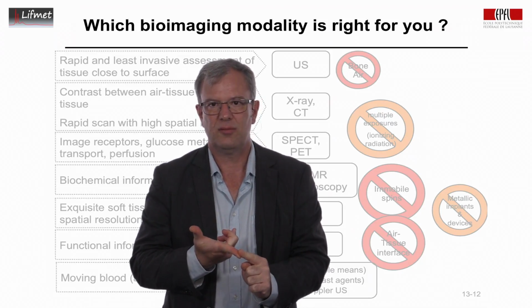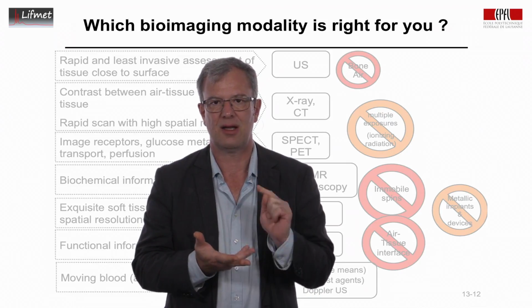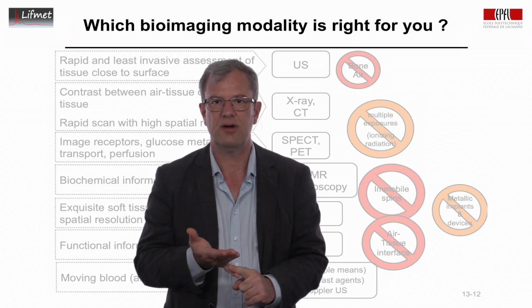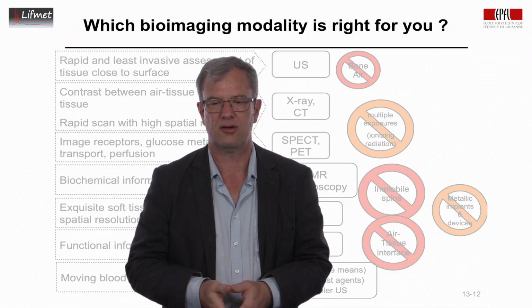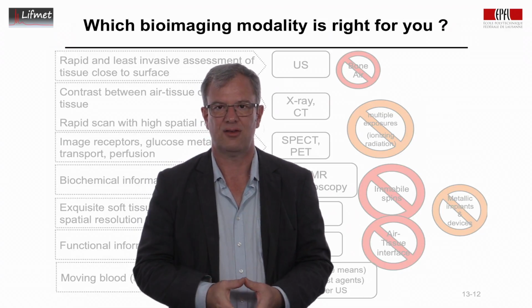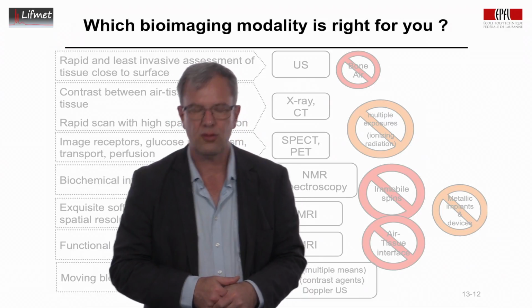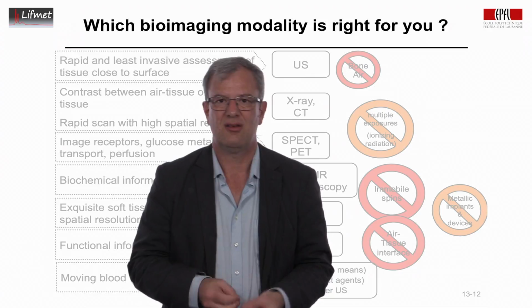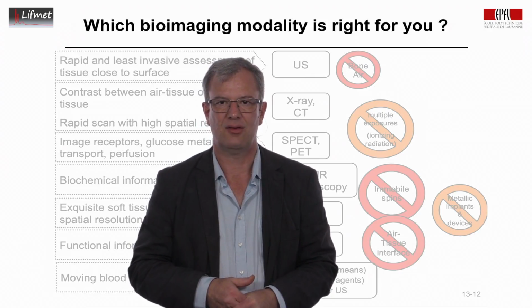You do not want to put them necessarily into an MRI unless you're absolutely sure there's no pacemaker or any metallic implant in the body. The consequences are devastating. However, to just detect whether the midline is displaced in the CT, there's sufficient contrast. This is done in a few seconds. It's also fast, gives you a fast assessment in this case. So there you would use, even though the soft tissue contrast is not very good, it is sufficient to detect the medical question at hand.